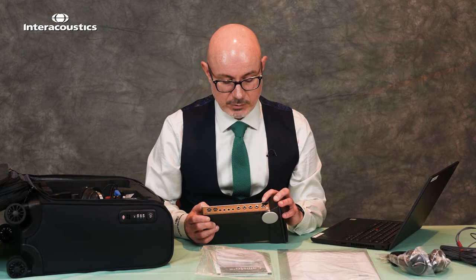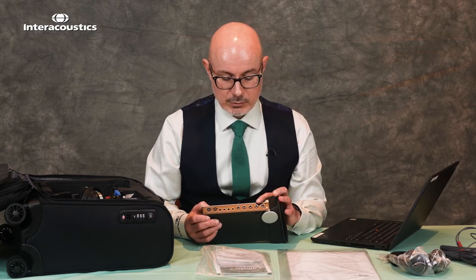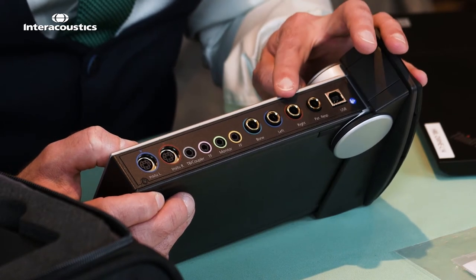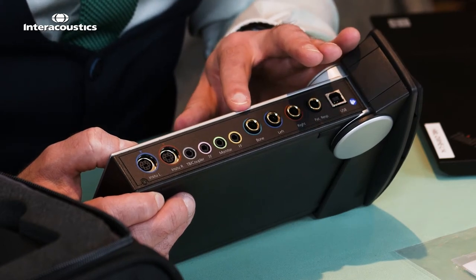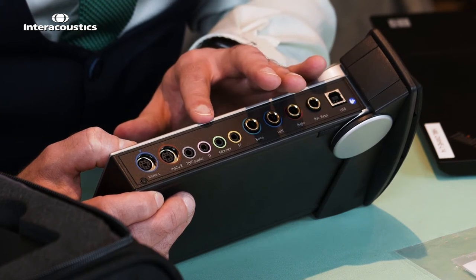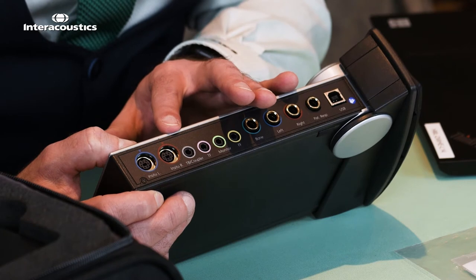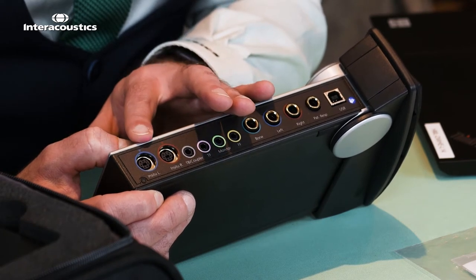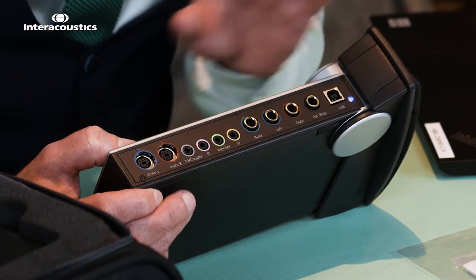Starting on the left hand side we have the USB connection for your laptop. Then we move into the ORD ports: we have the patient response, right and left ports for your headset and bone conduction, then we have a free field port, a monitor, a talk forward, and as an additional feature you have a test box or coupler solution. At the final part of the ports we have the real ear — the REM insert ports.